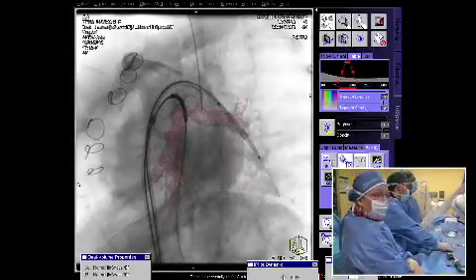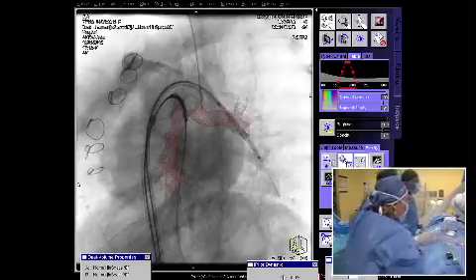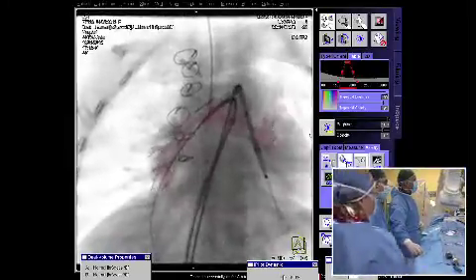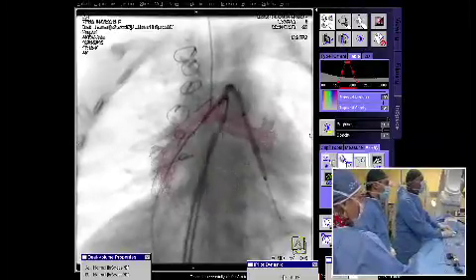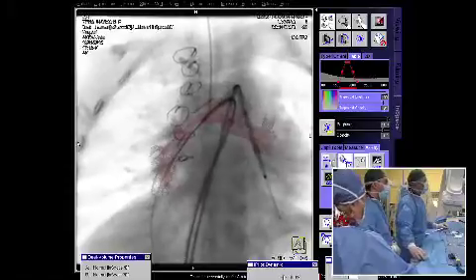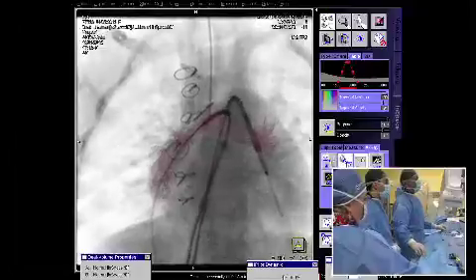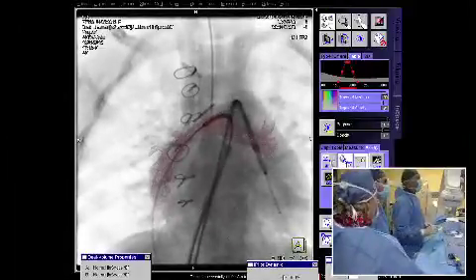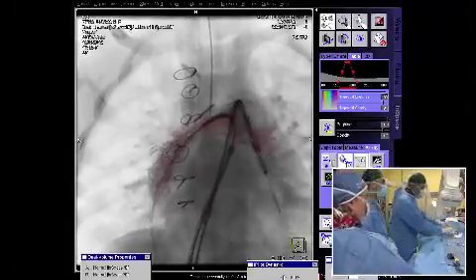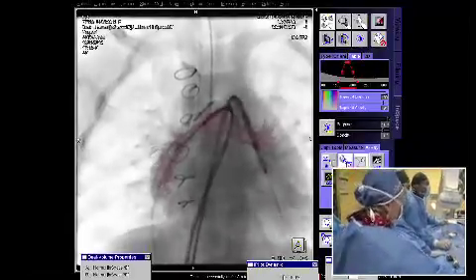Yeah, I misspoke. My point was we do lots and lots of 3D rotations. The roadmap is good, like for Cork and stuff. I'm not talking about the roadmap. I'm talking about from the image that you got, what angle did you go to? Forget the projection, forget the roadmap. Yeah, that's right. And then you use angiography to get you in the right projection. Yes. Facciamo così. Another angle. So we are just going through the standard approach with some angiographies that we should do.